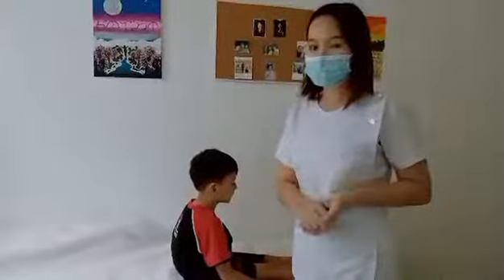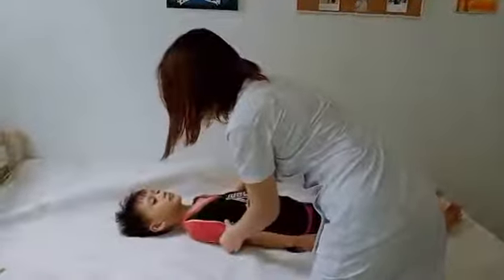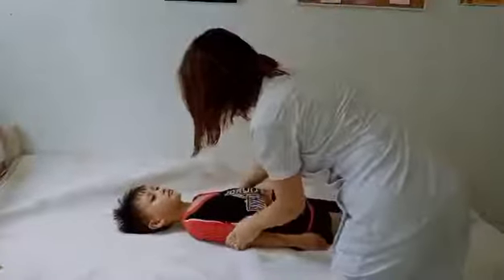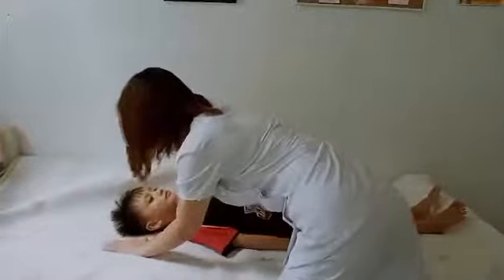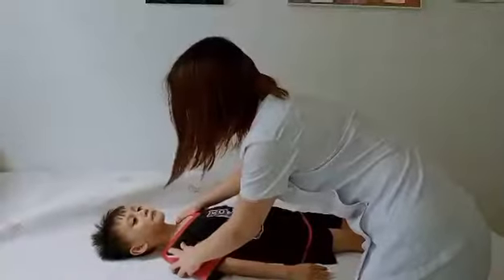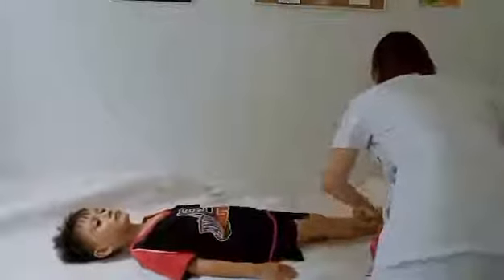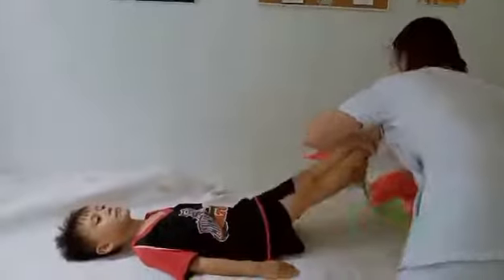Position of the patient. So first, place the patient in the supine position. Center the mid-sagittal plane of the body to the midline of the grid. So, imagine this is the grid here. And then, place the arms alongside of the body and adjust the shoulders in the same horizontal plane. And then, place a support under the knee for the patient's comfort.